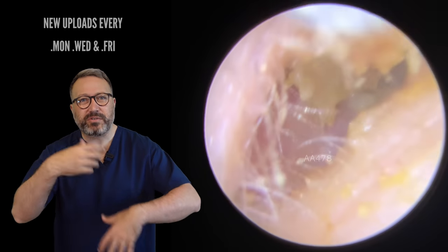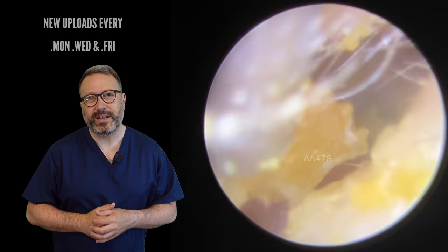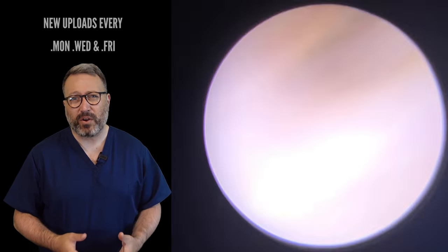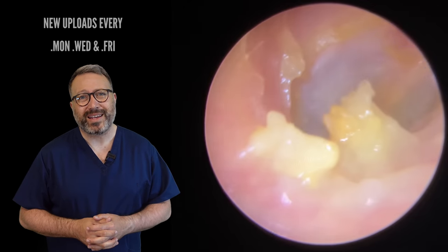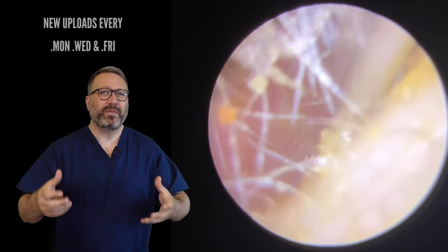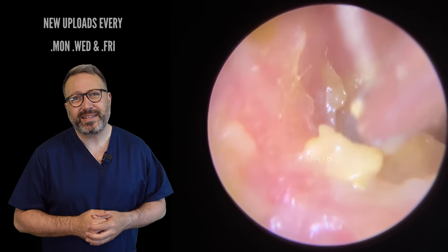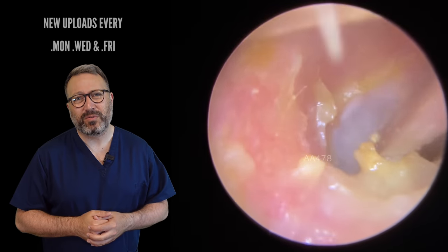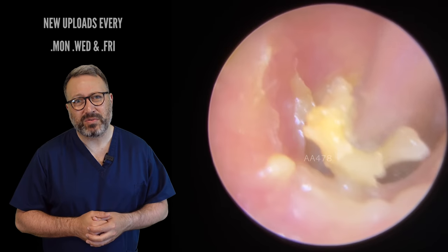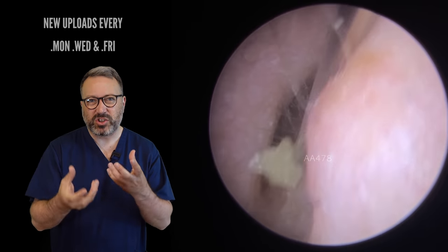You can see we've got this softer material now we've started to break this up, and it's all starting to free up in there. The patient was feeling really, really blocked up and not hearing very well at all. When we take a look behind, you can see all of the skin there is pink — it's not aggravated as such, but it's just really dry and irritated in there. We're just going to tidy up a little bit and avoid these canal walls as best we can. You can see how some of the wax right at the back has become really sloughy and soft — that can happen if water gets trapped behind the wax, which can really soften up the rear section.